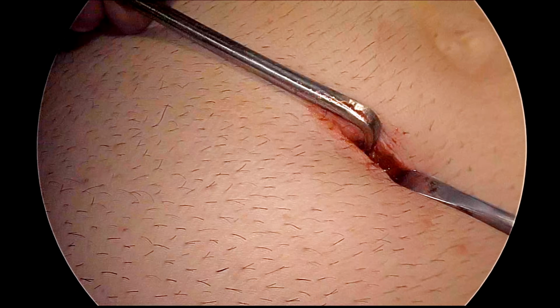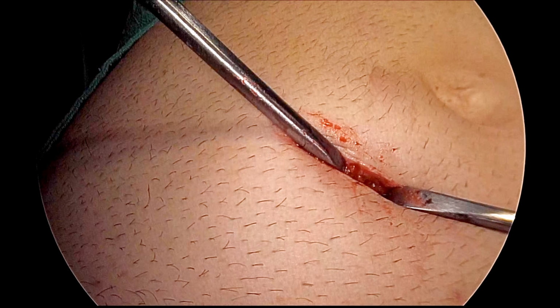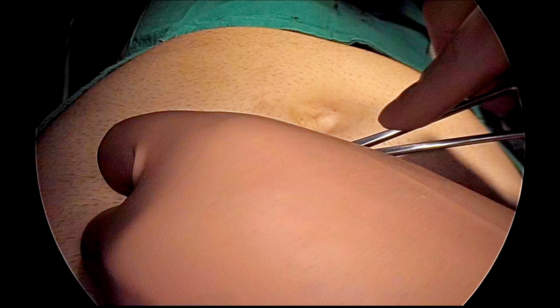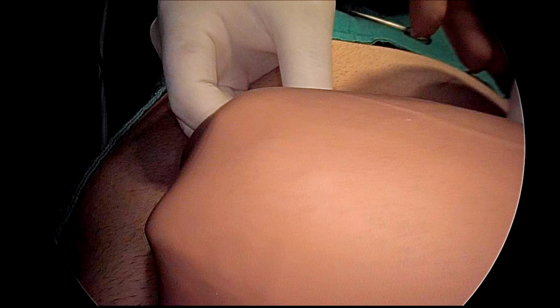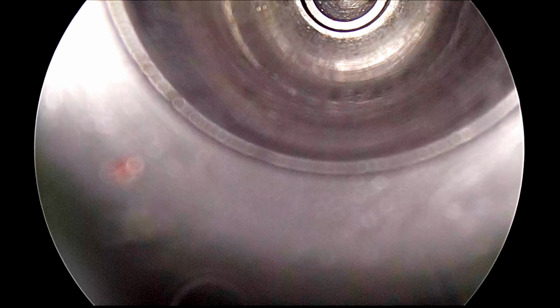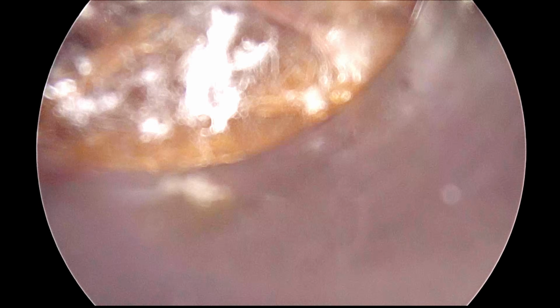After extending it we can see this is supraumbilical and a little towards the left. It is not completely on the midline, and below is the umbilicus, which you can easily see. After that this cannula will be introduced and we will point it towards the left inguinal region. Then you will try to lock it because gas may leak. Here we are not using the commercially available balloon dilating cannula, we are using a simple cannula. To prevent gas leak you can put a sponge all around the cannula, and with the tip of the telescope we can start making a preperitoneal pocket.